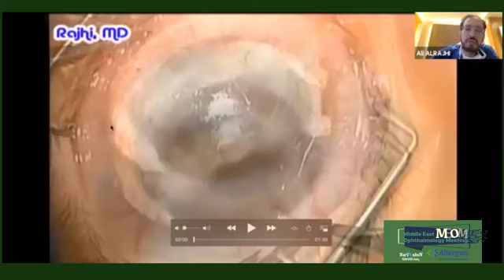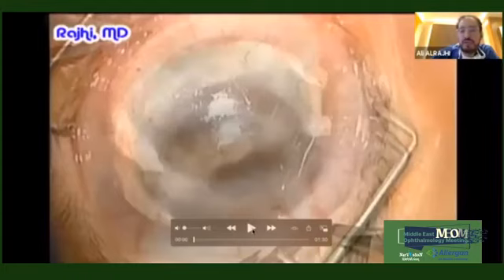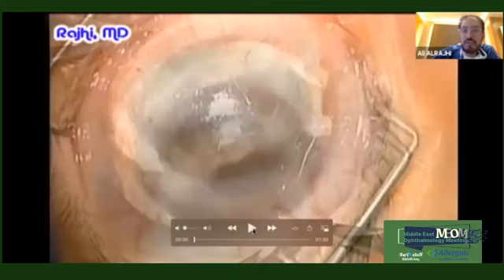All sutures were to the limbus. And the remaining cornea here, which is attached, is with fibrin glue and amniotic membrane. She developed cataract and she has glaucoma, and we have difficulty in IOL calculation and in how to approach her, whether to do corneal or scleral. Since she has Ehlers-Danlos syndrome, both cornea and sclera are thin. So we want to do cataract aspiration since she is probably in her teens, 15 or 16 years of age.